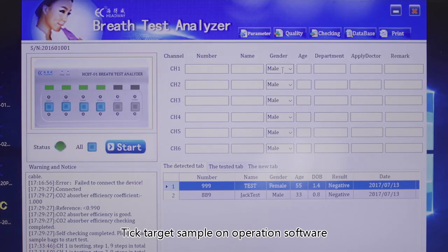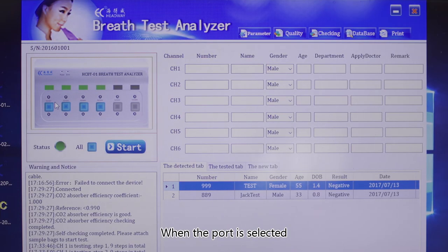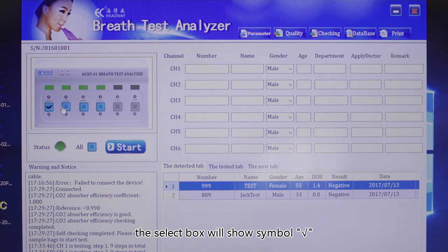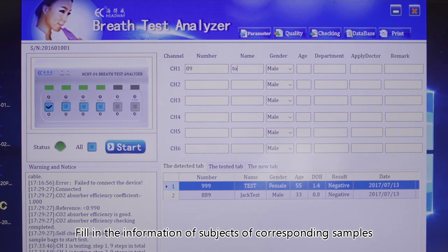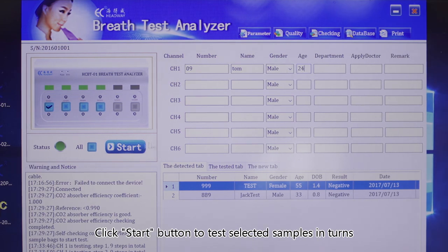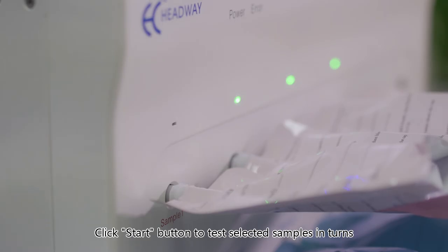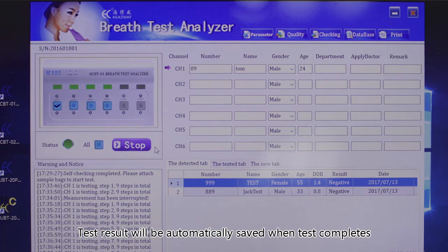Tick target sample on operation software. When the port is selected, the select box will show a checkmark symbol. Fill in the information of subjects of corresponding samples. Click Start button to test selected samples in turns.